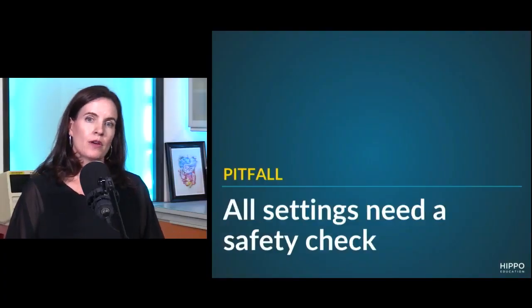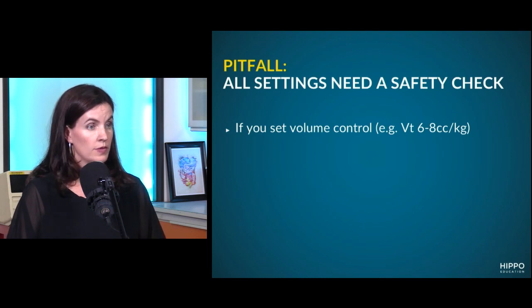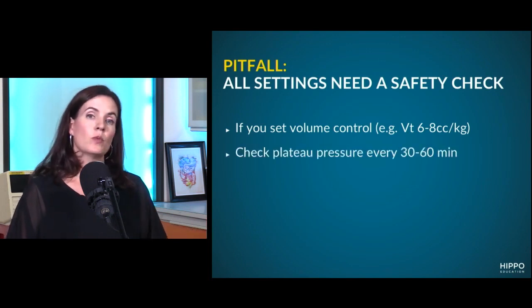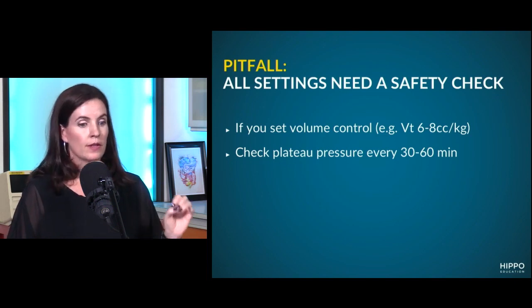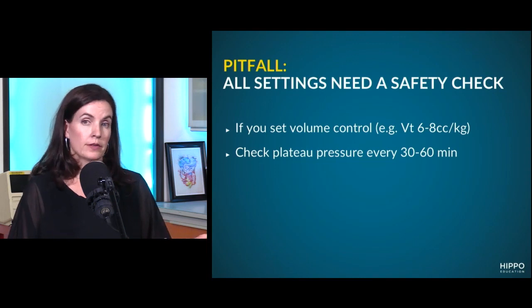All right. The second tip here is that all of your initial settings need a safety check to make sure they are reasonable. So if you have started by setting a volume control mode, so you've set a tidal volume, say we've set for Paul his 420 cc's, which was 6 cc's per kilo to start out with, I then want to have a look on the ventilator at my plateau pressures. And this is something that the vent will just display to you. It will say plateau pressure or it will say P plat. And you can look at what that number is on a breath-to-breath basis, typically.